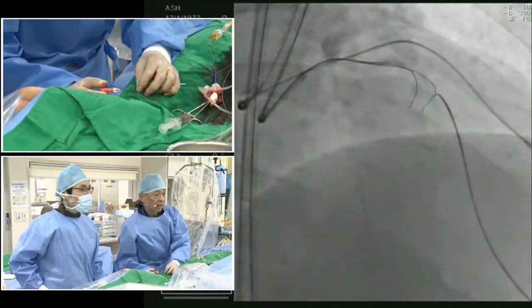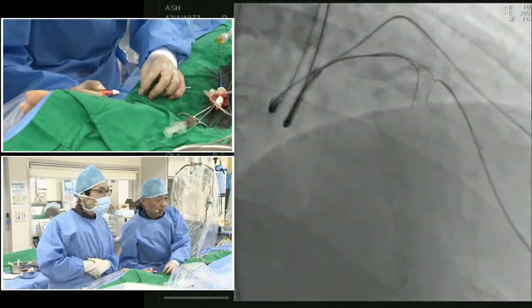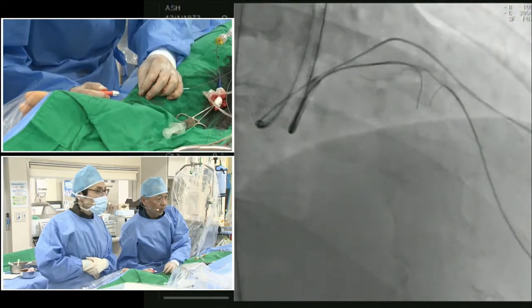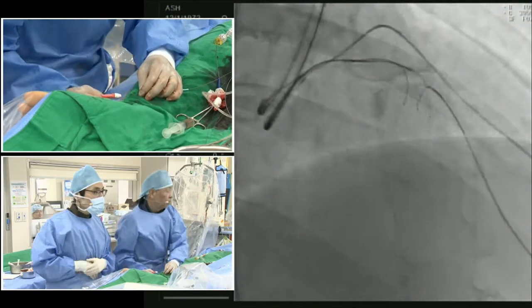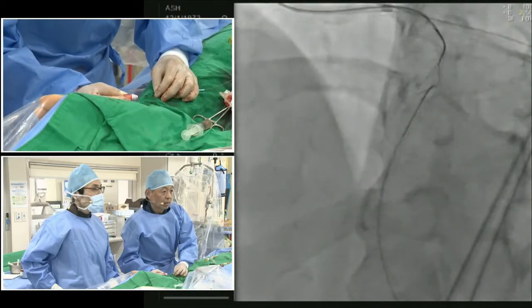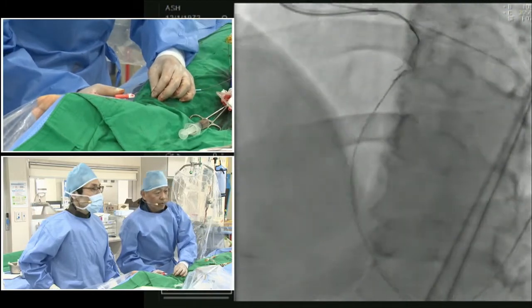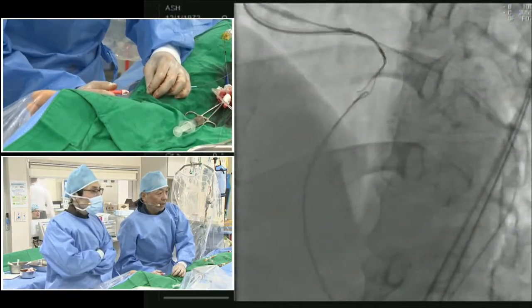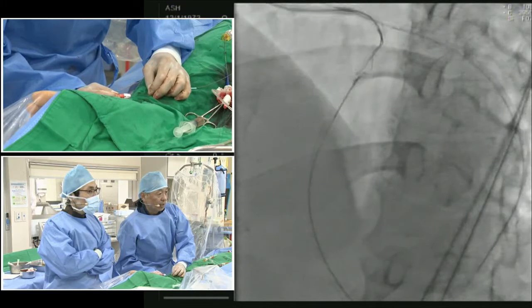How about? Okay, like this. Yeah, usually go to septal. So for this wiring, I think a parallel biplane system is better. Maybe subintima. Okay, back to. If possible, I want to preserve the patency of this septal branch. However, I think diagonal branch patency is more important. So at this timing, I advance this guide wire more deeply.